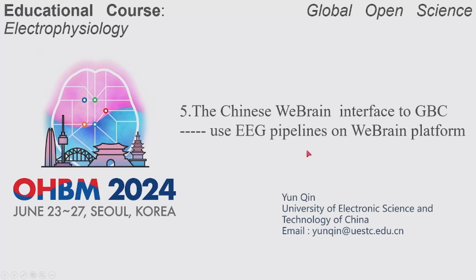Okay, hello everyone. I'm so glad to be here to be part of the educational course Global Open Science Electrophysiology. And today I'll introduce the Chinese interface, the WeBrain platform to GBC.